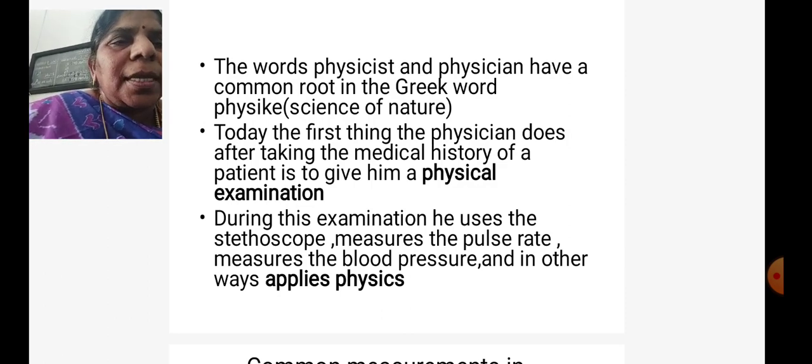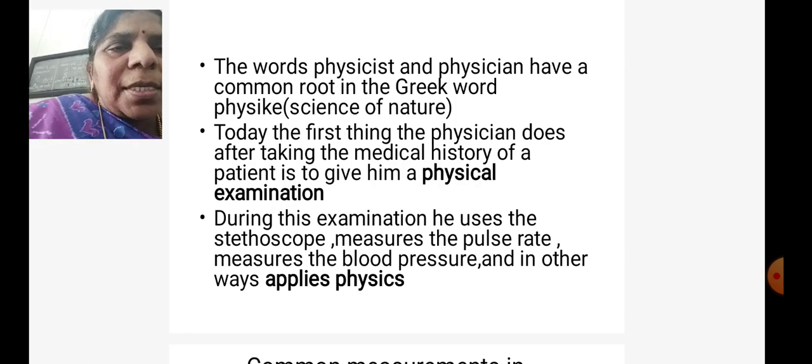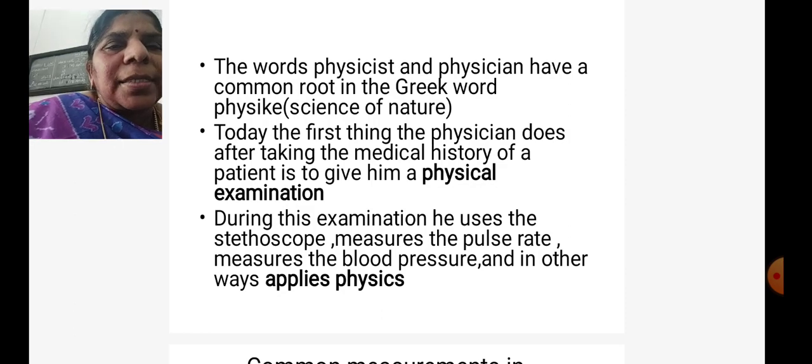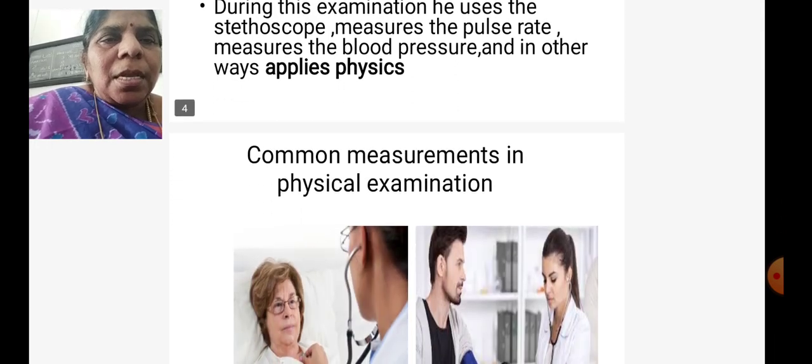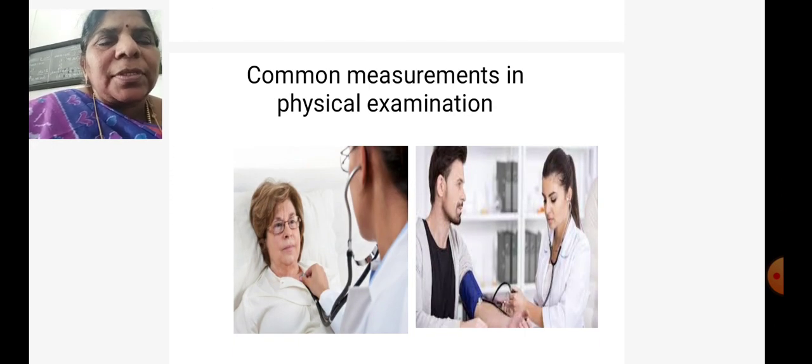Today, the first thing the physician does after taking the medical history of a patient is to give him a physical examination. During this examination, he uses the stethoscope, measures the pulse rate, measures the blood pressure, and in other ways, it is nothing but applied physics. Some of the common measurements in physical examinations you can see in this picture. The first one is the stethoscope, which gives you the pulse rate.